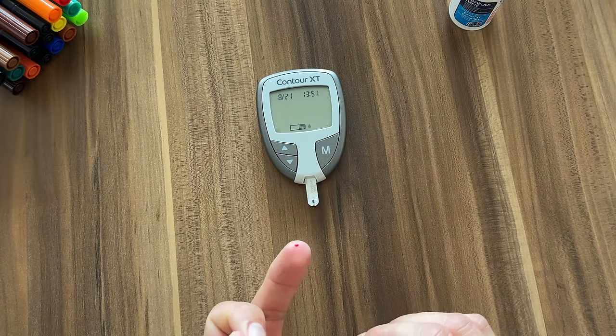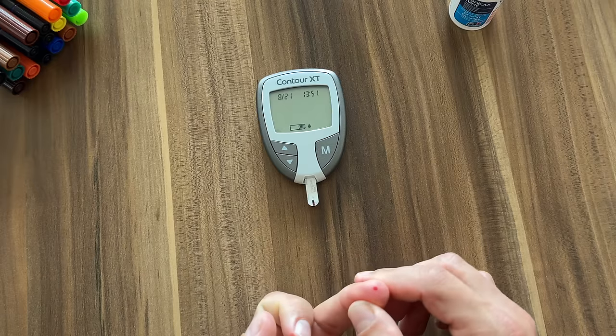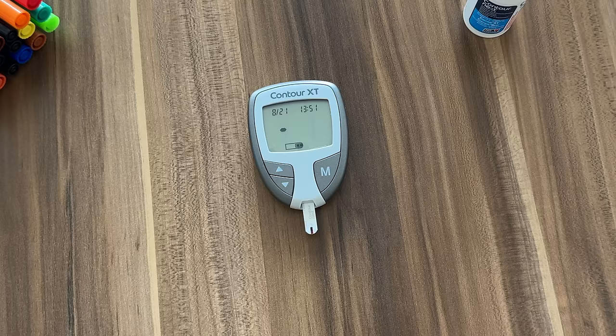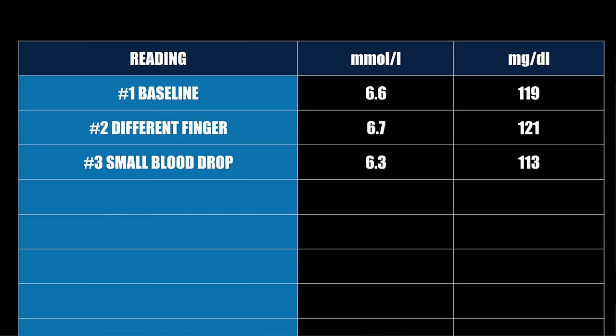For reading number three I'm going to use a smaller drop of blood — putting a little less blood on the test strip to see if that makes a difference. If you're like me, you might be tempted to do this when you can't draw more blood and don't feel like doing another finger prick. Many modern meters don't require a lot of blood, but if you don't put enough they might give you an error code. Mine didn't give an error, but the reading with less blood gave a quite a bit lower number — only 6.3 millimole or 113 milligrams per deciliter. For best accuracy, always make sure your blood fills the strip all the way.